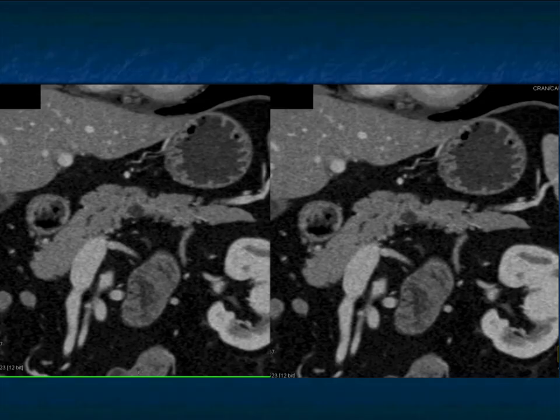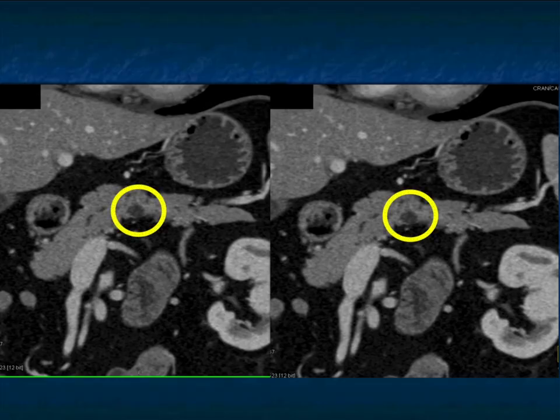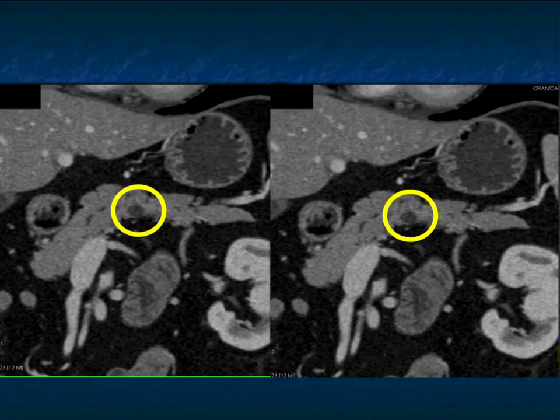Here's a good example of a side branch IPMN, a little bit under a centimeter. This case makes the point how much easier it is at times to see small cystic lesions when you look at the coronal display. Sometimes you can use software which does centerline tracking through the pancreatic gland, laying or filleting the gland open, which can be very helpful. You can see the small IPMN — it's a centimeter. There's no dilated pancreatic duct, but if you look carefully, you can see a communication with the pancreatic duct, though MR can do this a little bit better.